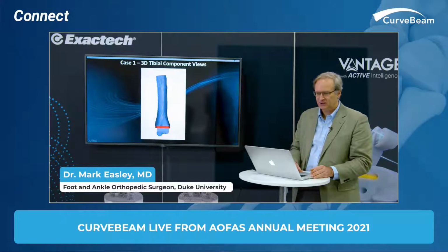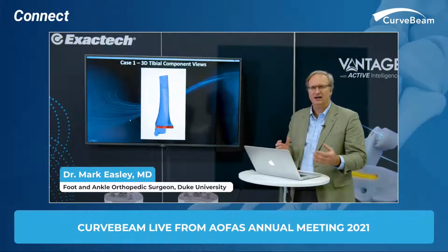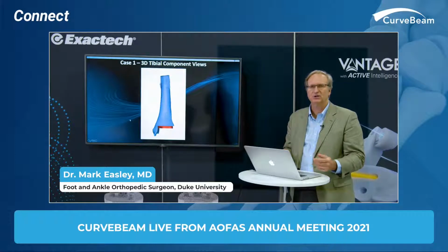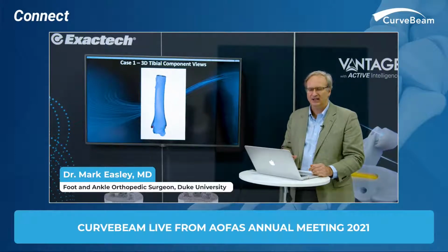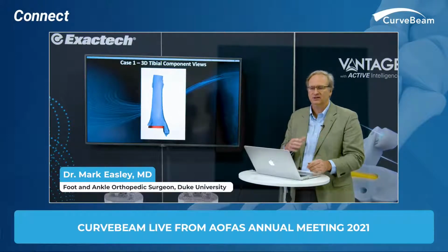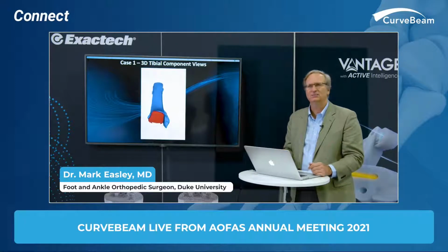And then this here is an example of what you can do. And see, I love this technology. It's not just looking in 2 dimensions, but I'm truly looking at it in 3 dimensions. And I'll know exactly where that component's going to sit. And it's all on me. The onus is on me to make sure that I put it exactly in the position I want it to be.